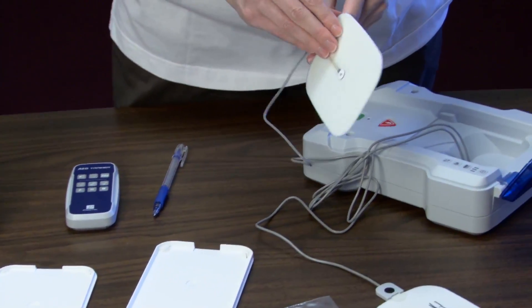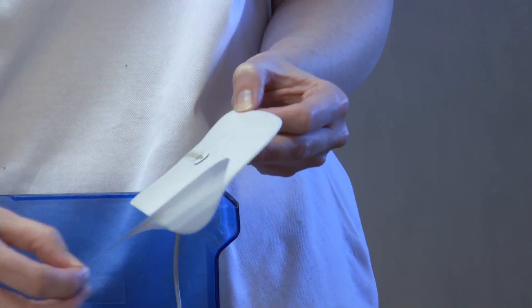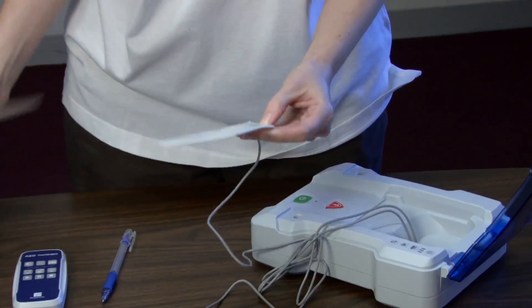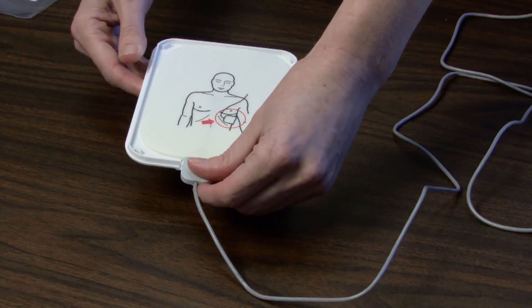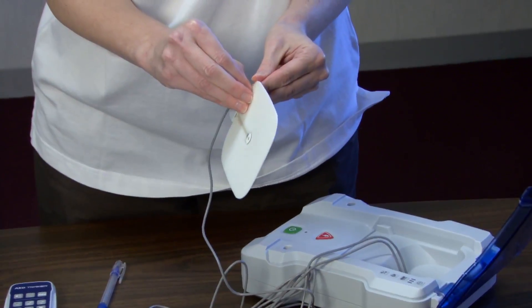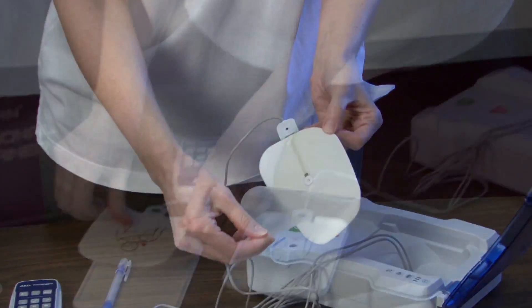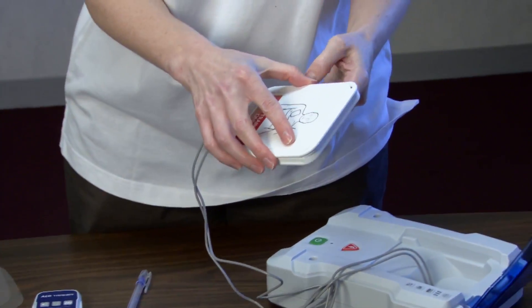Turn the pad over to remove the clear plastic liner from the AED training pad by gently pushing down on the tab end of the pad. Gently separate the pad from the liner and adhere it to the inside of the white plastic training pad case, matching the tab end of the pad with the case's notch. Repeat this process with the other training pad. To finish, close the case and discard the liner.